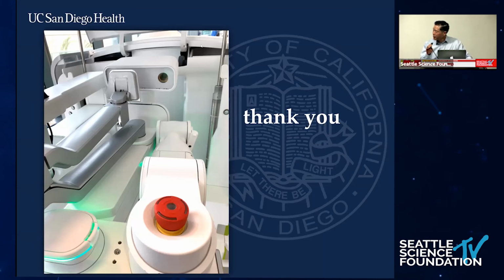I actually agree with you. Just for pedicle screw accuracy, that's really been what's promoted with robotics, and it's not a value add. I don't think it's any better than conventional navigation. It doesn't justify the cost. So it really comes down to what else it offers, and the ability for predictive analytics, which is also in its infancy, I think is going to be a big plus for the robot, as well as increasing everybody's technical skills to a certain level. It does actually ease some of the physical demands of an operation, as you mentioned. So those are two big points that I think I've personally found to be a use for the robot.